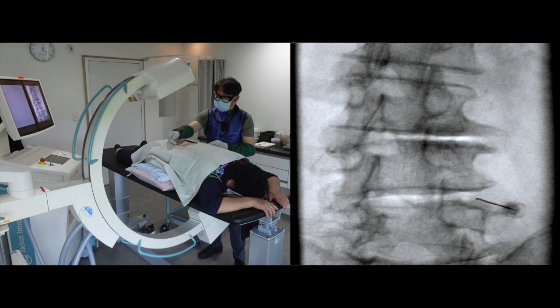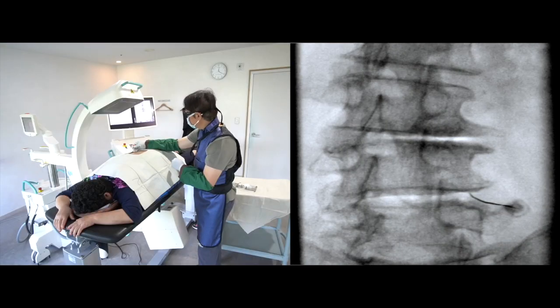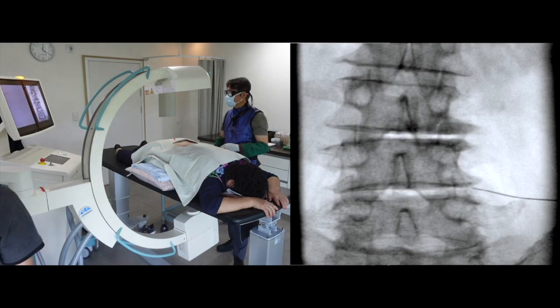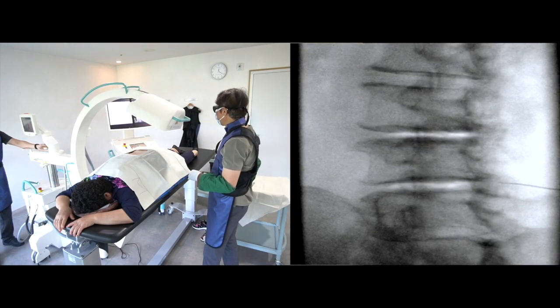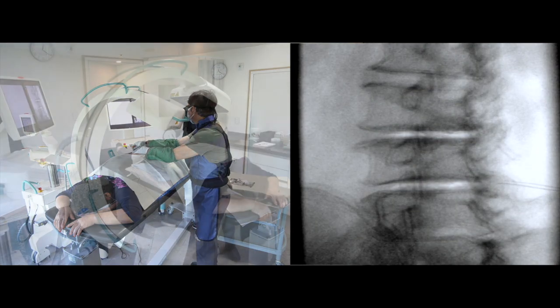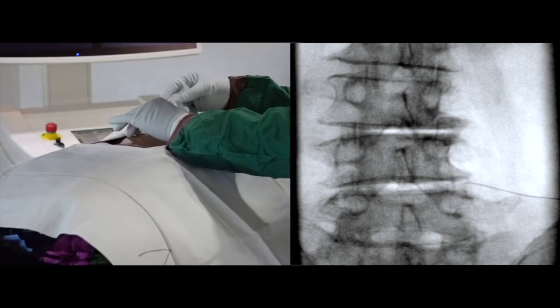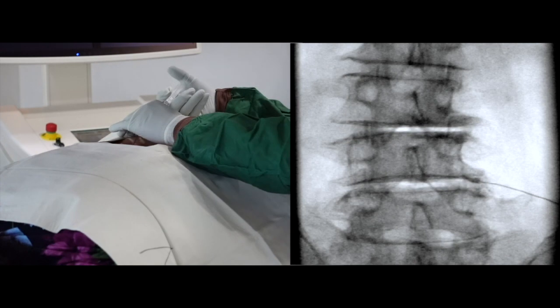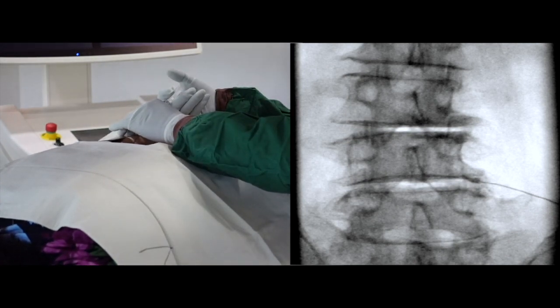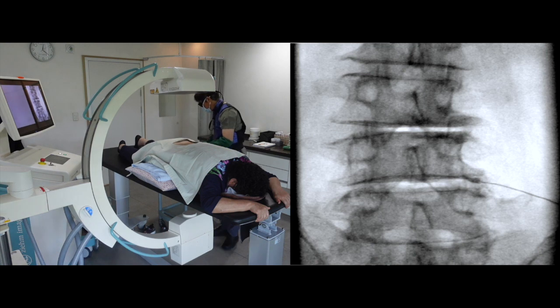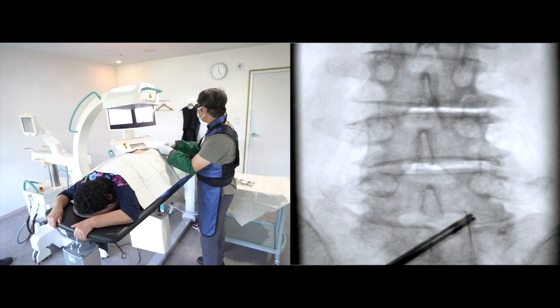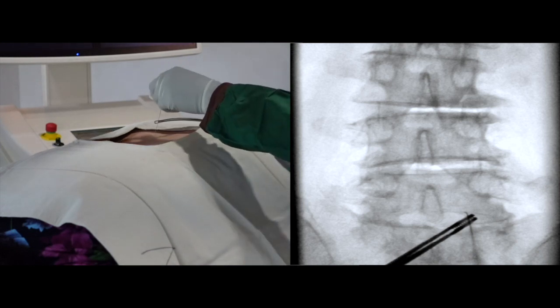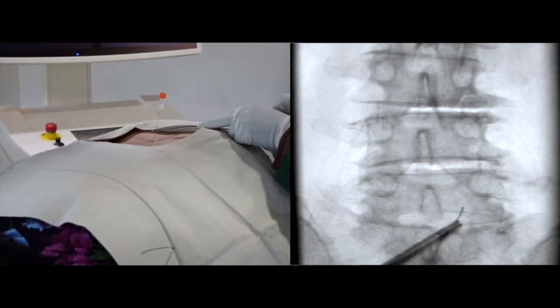It is very common to puncture the disc in a severely protruded disc. AP view. The contralateral oblique view to measure the needle depth. Contrast media injection on AP view. I will administer a steroid mixture which contains 50 units of botulinum toxin and 30 mg of triamcinolone. This is my main target — the right L4-5 facet joint. I will go from posterior inferior to superior direction targeting the inferior recess.